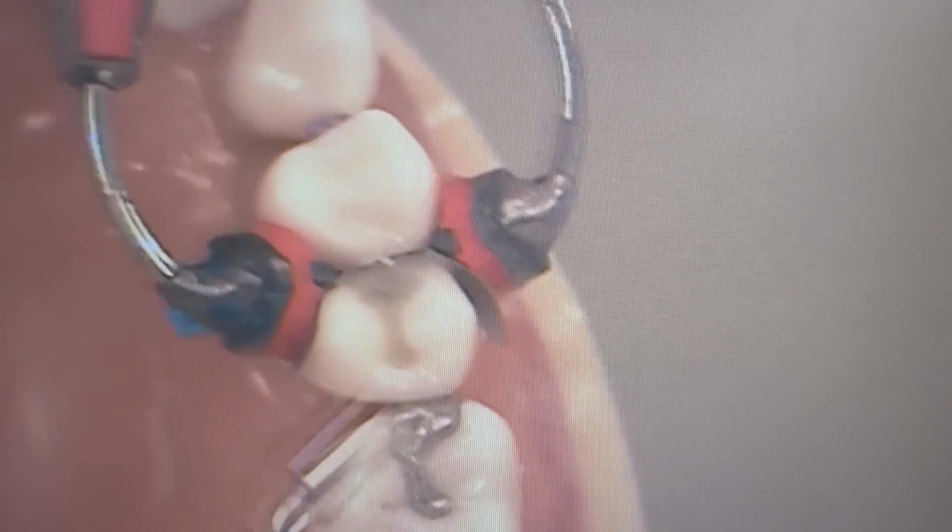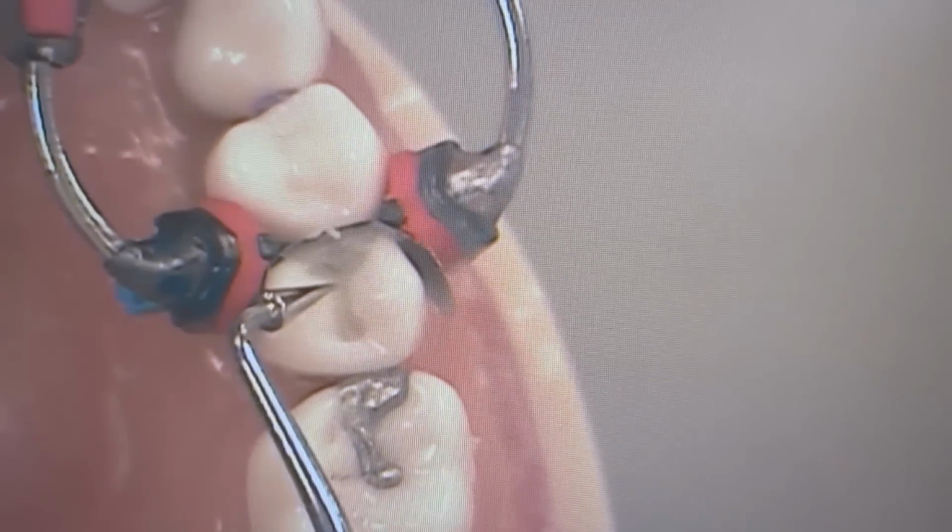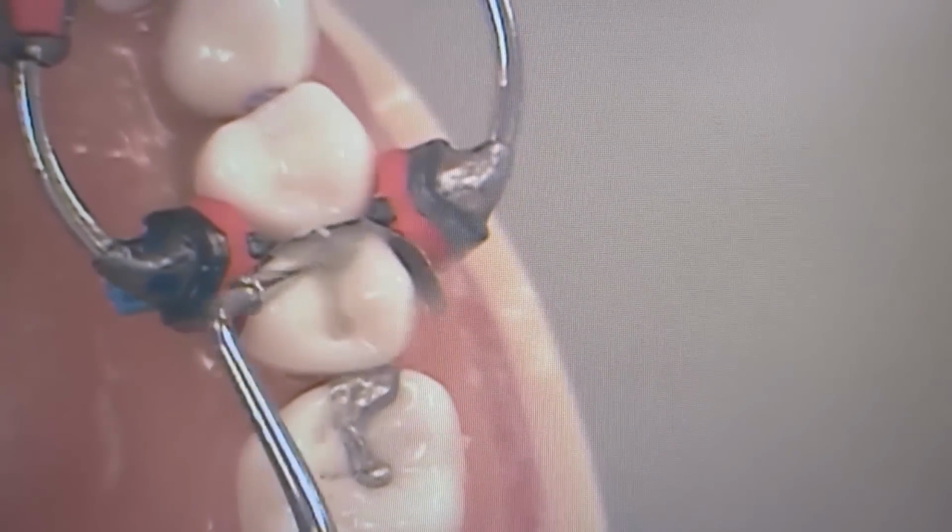The key to this, mostly I'm spending my time to remove the excess composite. So removing the excess composite now.